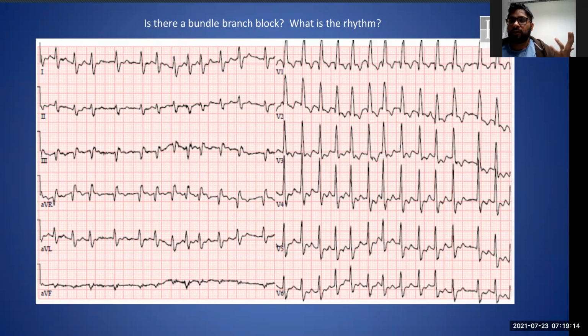But if I interpret it as an RSR, then I'm saying no, I don't see P waves. If I can paraphrase you, before we jump to a diagnosis, it's pretty difficult to determine if there are any P waves there. Is that a reasonable different way of expressing what you're saying? So what if we take a step back: it's fast, is it regular or irregular?